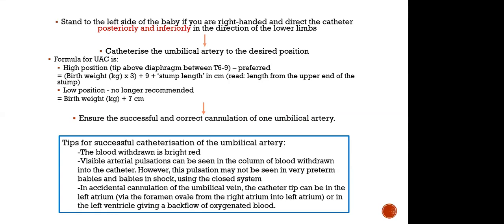So when you put the catheter down at the same level as the heart, you will see the blood starts to flow back. This is venous. When you put it up against gravity, the blood will slowly go down. So this is venous. If arterial, if you put it up against gravity, it will still go up. So that's actually the easiest way to assess venous or arterial. Okay, all right. That's it.